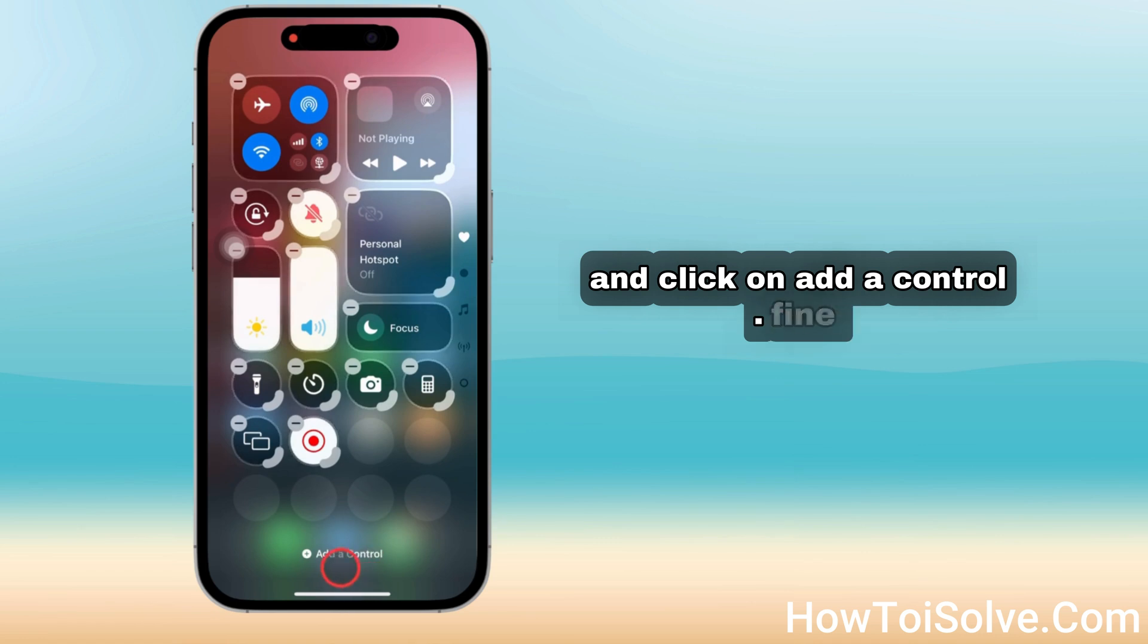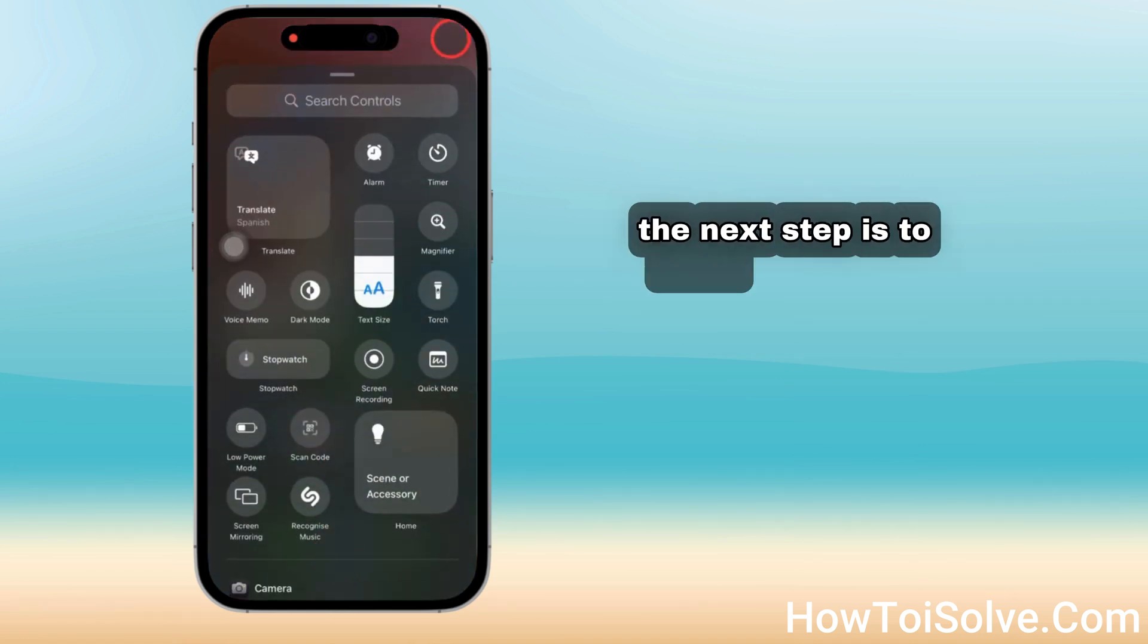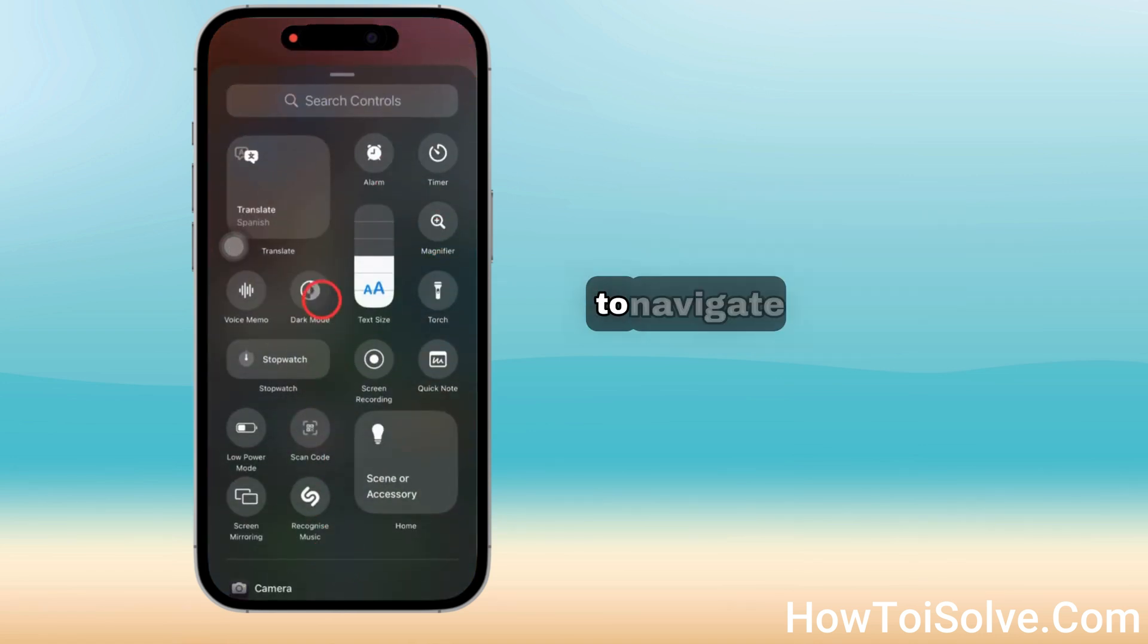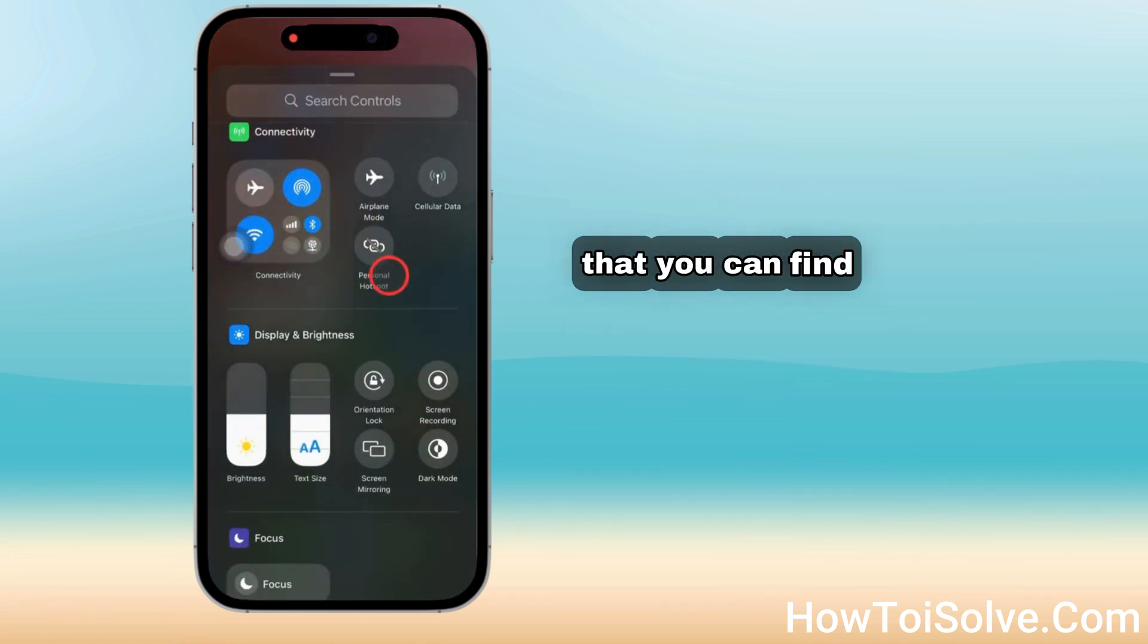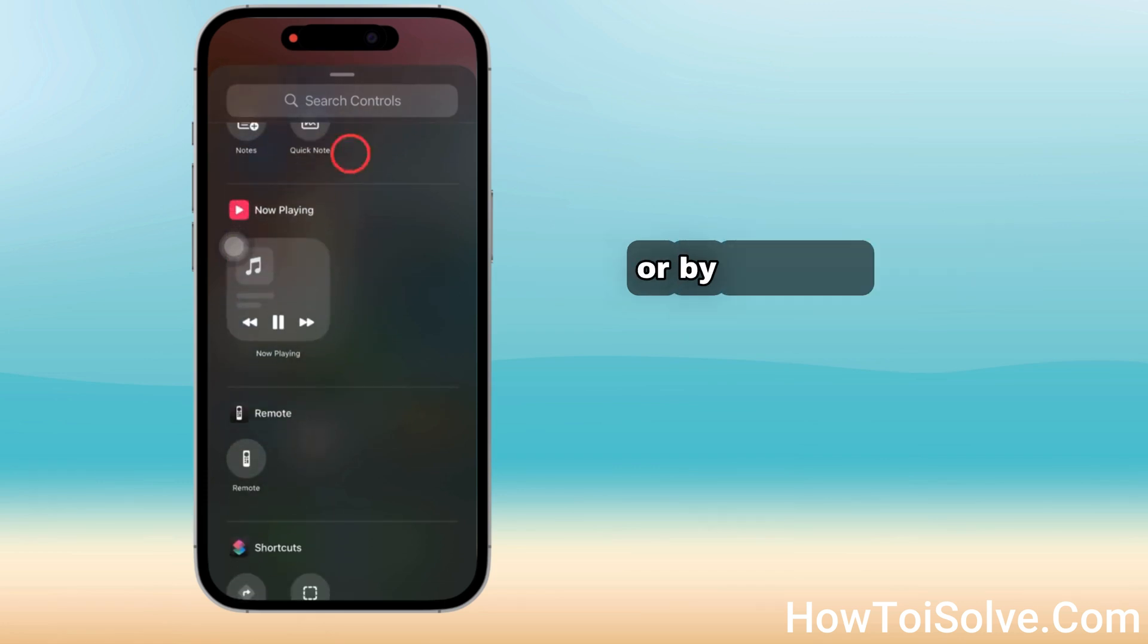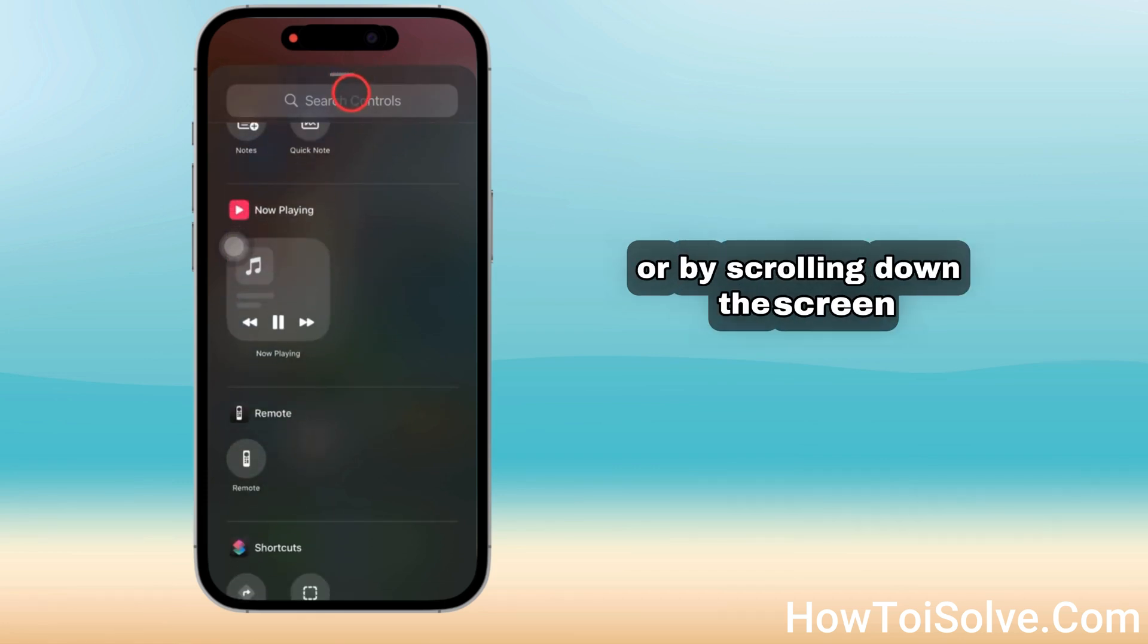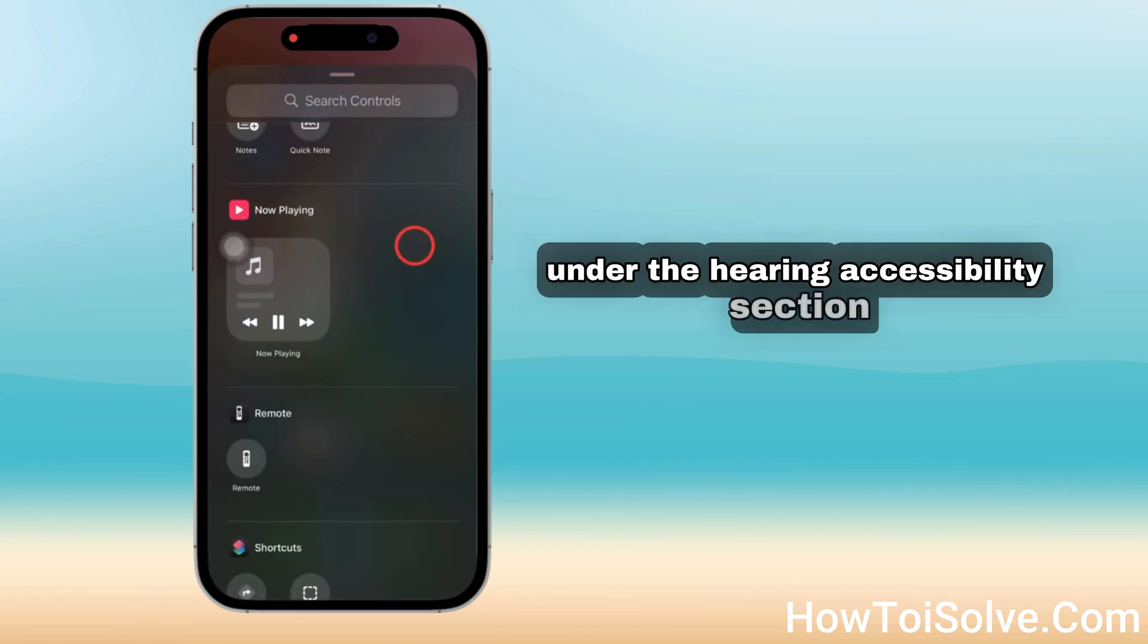The next step is to scroll the screen to navigate to the hearing control. You can find it via the search bar or by scrolling down the screen under the hearing accessibility section.